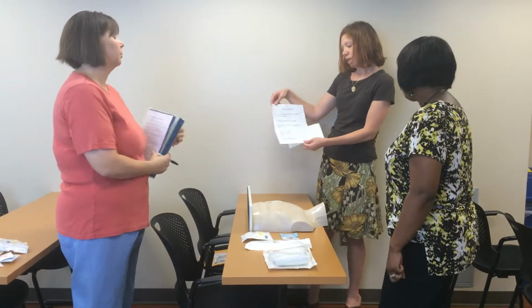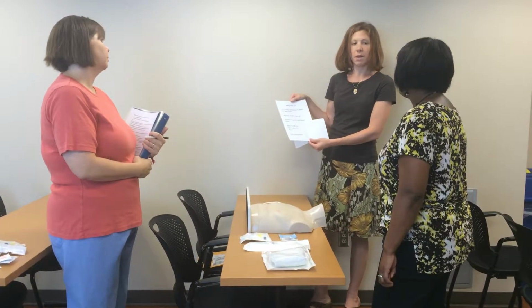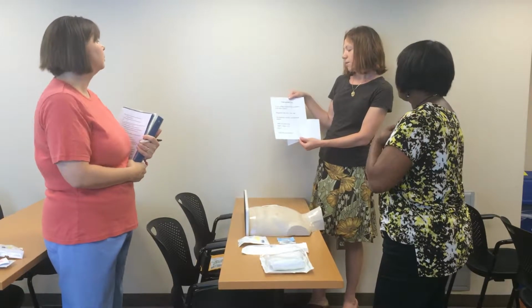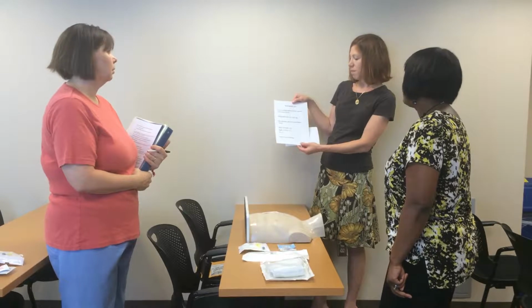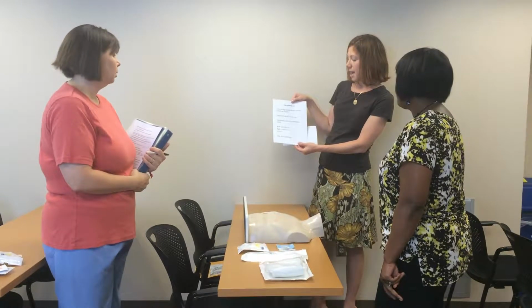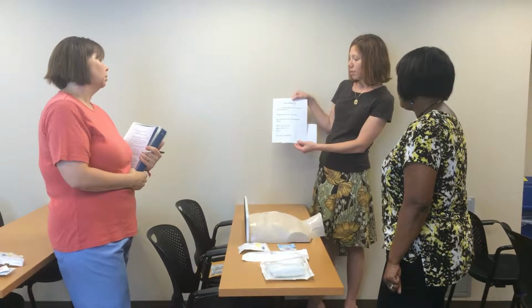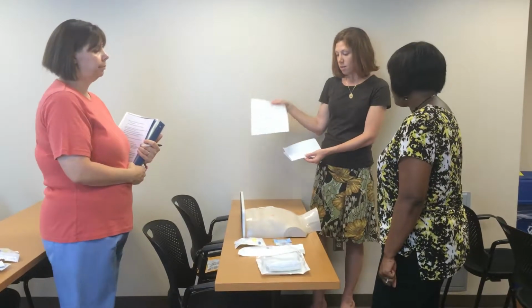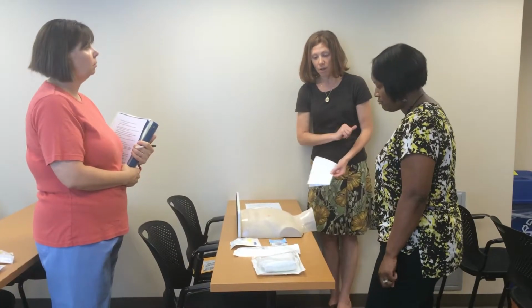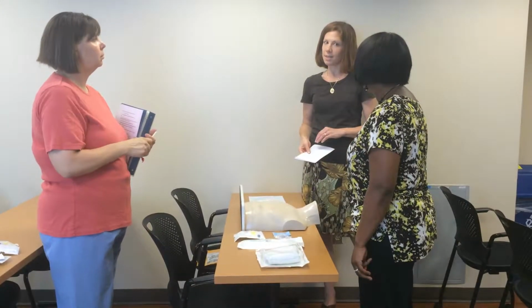No, ma'am. Okay. Well, let me tell you a little bit about JG then, and I'll leave this here for you so that you can remember. JG is a 21-year-old college student who lives with his parents and is on a leave of absence from school. He was diagnosed with ALL 2 months ago. He's had his induction and he's here for consolidation chemotherapy. His white cells are 0.8, ANC is 0.4, hemoglobin and hematocrit are 11 and 27.2. His platelets are 15. His vital signs are stable and he has no signs and symptoms of infection. So Ashley, if you begin, you should have all of the supplies you need, talking to us about how you would access his central line.